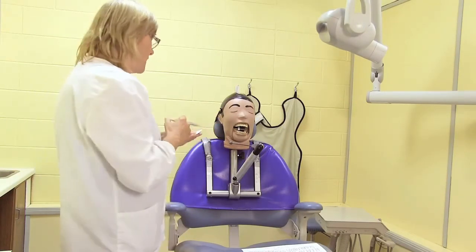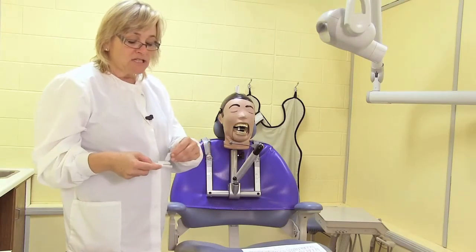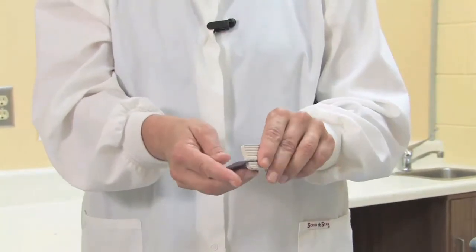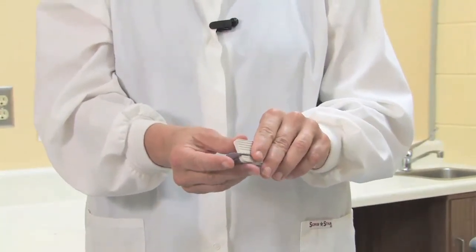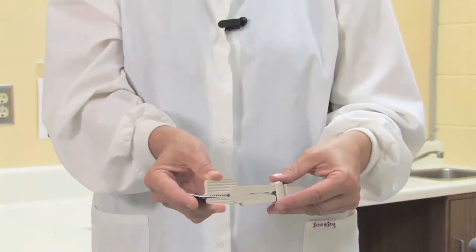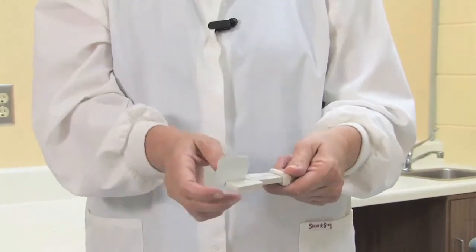Next thing to always remember is dot in the slot, to ensure that the dot is at the occlusal edge. Make sure the film is flush with the bite tab. And again, remember your white side is your exposure side.